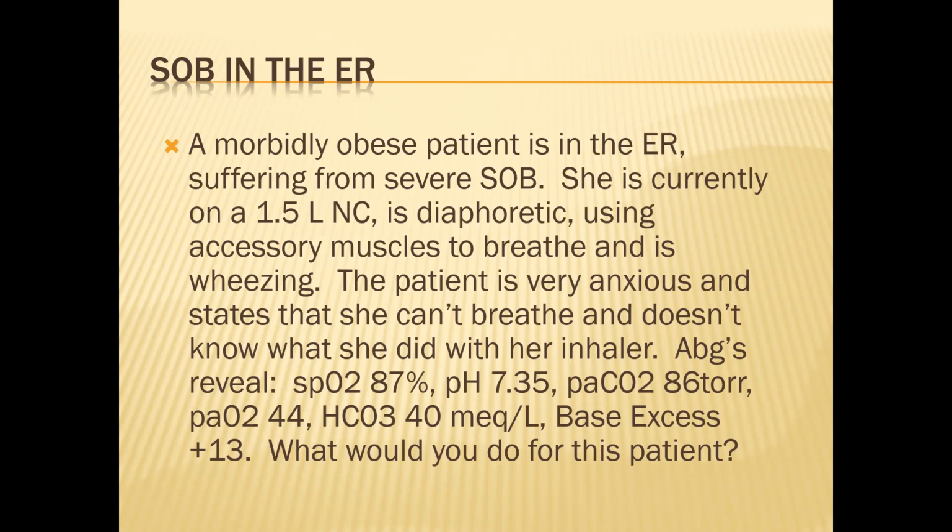So once we put her on BiPAP, we don't need the venti mask. Good point. So that answer would be an or, not an and. Or instead of the venti mask, we would switch her over to BiPAP and then just deliver oxygen via BiPAP. 12/6 and just look at her tidal volume.